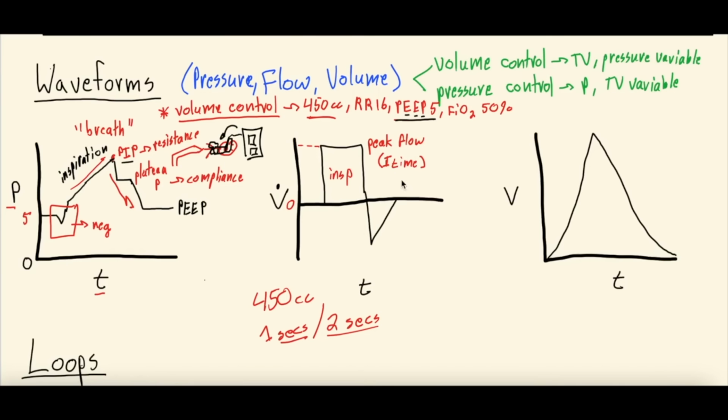Hopefully it does. This bottom part here is expiration, right? So negative flow, they're expiring back at the ventilator. And it should always return to 0 here, right? It starts at 0 and it returns to 0. Again, we're going to go into abnormalities at another time, but something you sometimes see is if this does not go back to 0, we're just going to erase that.